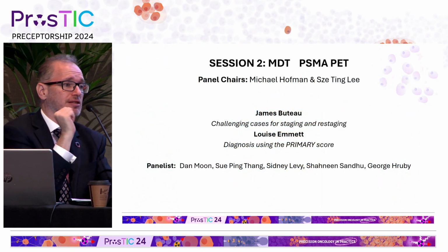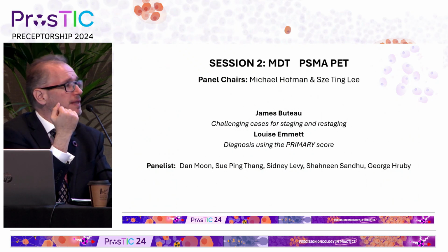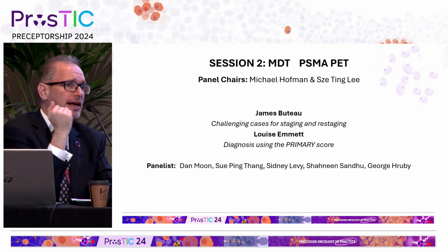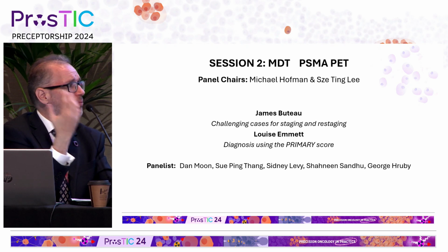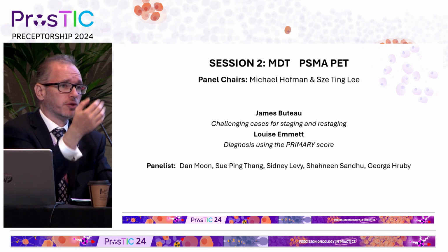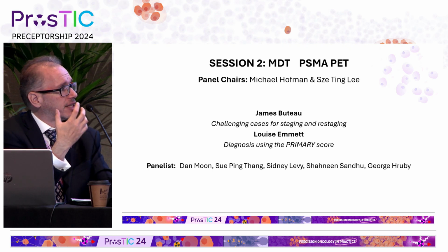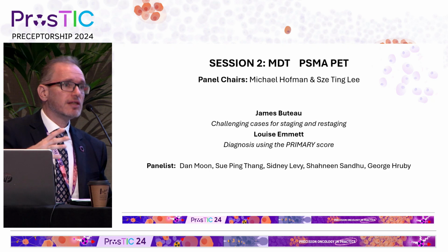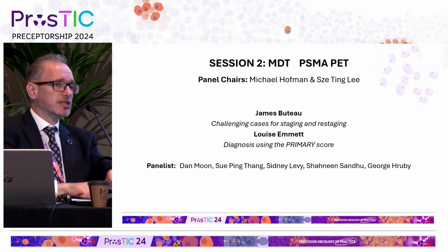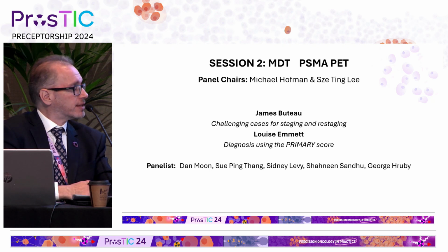Maybe just make a point that we were reviewing the cases with our software. We use MIM. But whatever software you use, one of the problems at the moment is our hospital PACS systems often don't let you fully review PET studies, and you're viewing just a fused series, which is really suboptimal. To review these scans properly, you need to be able to window the PET image and zoom the PET image. So try to get some software in your hospital so that in the MDT, you can review your PET scans like you would in the clinic.